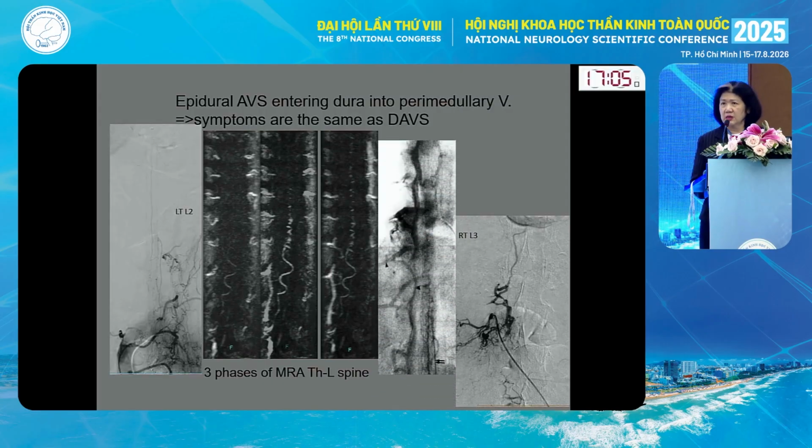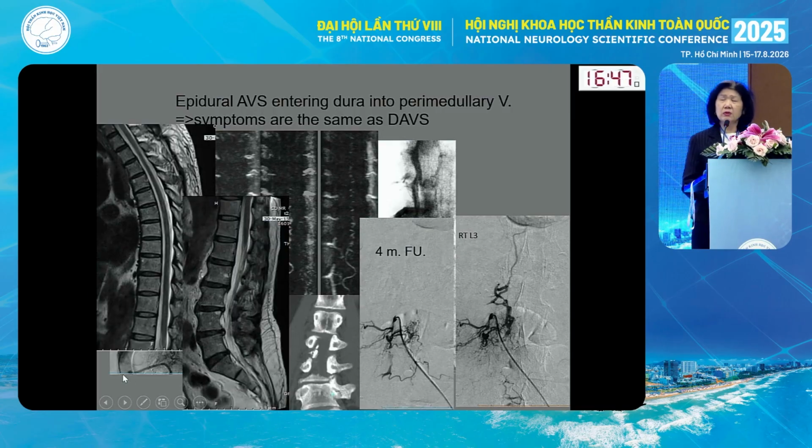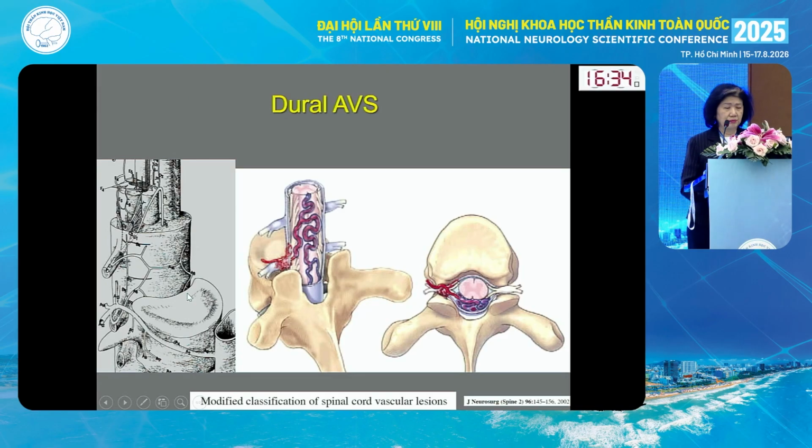And this is the same patient. You see that exactly at the right L3 level, you hook into this and find the shunt located there. For sure, you need to protect the normal spinal cord feeders. Now you save a lot of time by putting in the embolic material, and this is before and after treatment. You can cure the disease and the myelopathy returns back to normal.